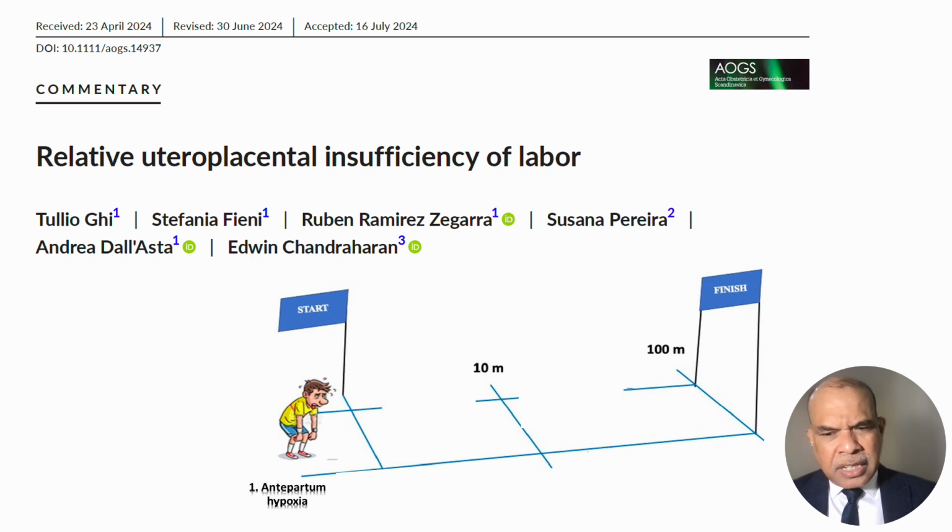But imagine a fetus comes to you with subclinical placental insufficiency, because the Doppler changes will only be seen on ultrasound scan and Doppler if more than 50% of the placenta is damaged. What if the fetus comes to you with a 20-25% loss of placental function? You put a CTG at the beginning of labor, that fetus is going to be absolutely fine.